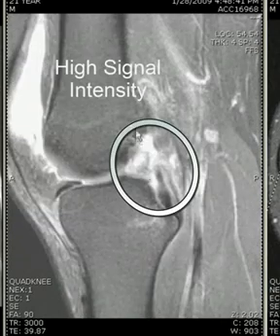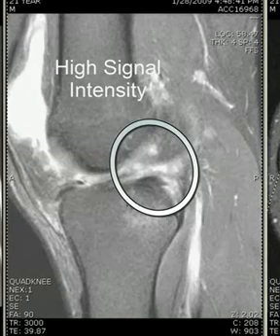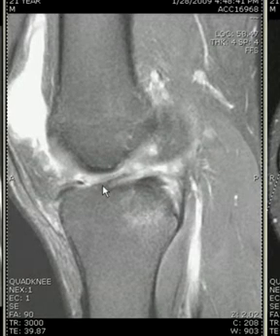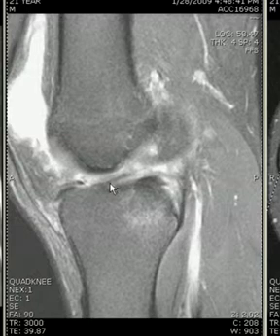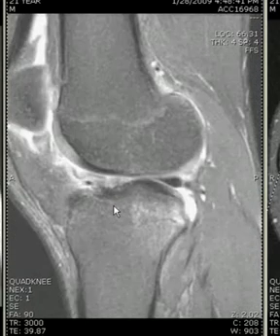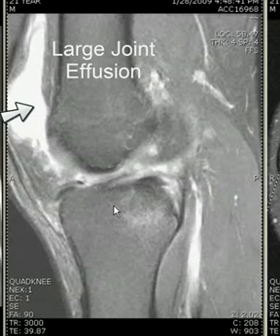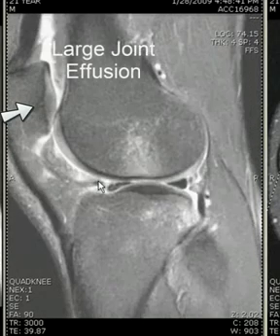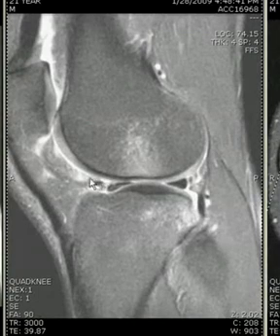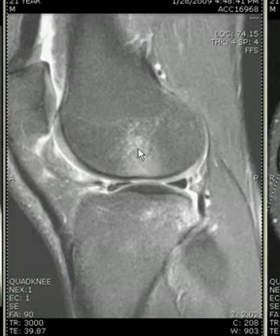There is extensive high signal intensity representing a complete tear, and the anterior distal portion of the anterior cruciate ligament is much too horizontal in position, consistent also with that complete tear. There is a moderate to large knee joint effusion in the suprapatellar bursa. As we move toward the lateral meniscus, we can see the typical pivot shift bone contusion pattern.